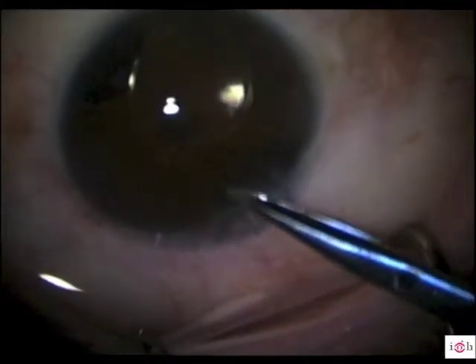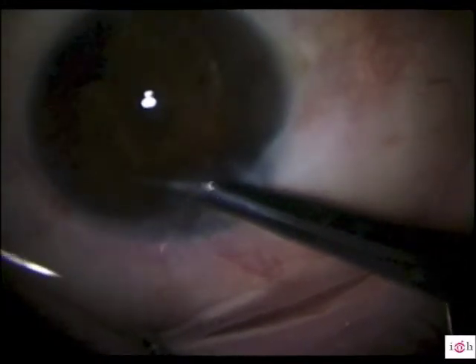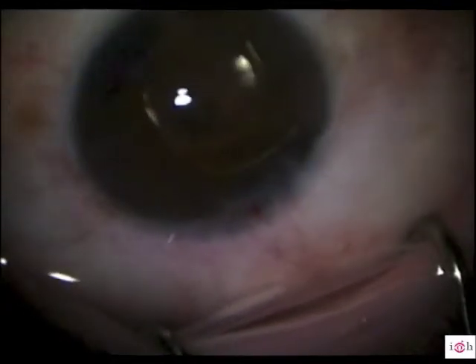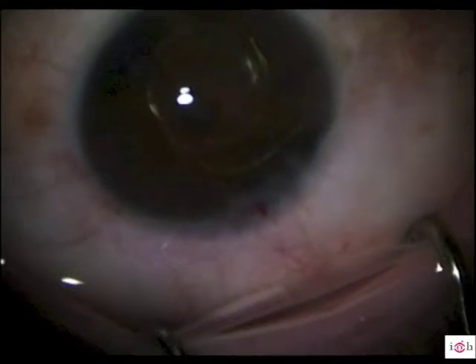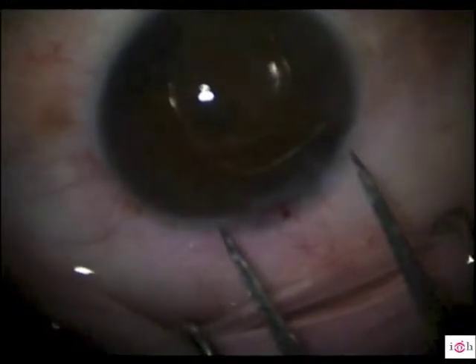It was impossible to release the superior haptic, and we decided to cut the haptic with Vannas scissors and to remove the IOL in 2 separate parts. We measured the IOL optic diameter with a caliper in order to enlarge the corneal incision.